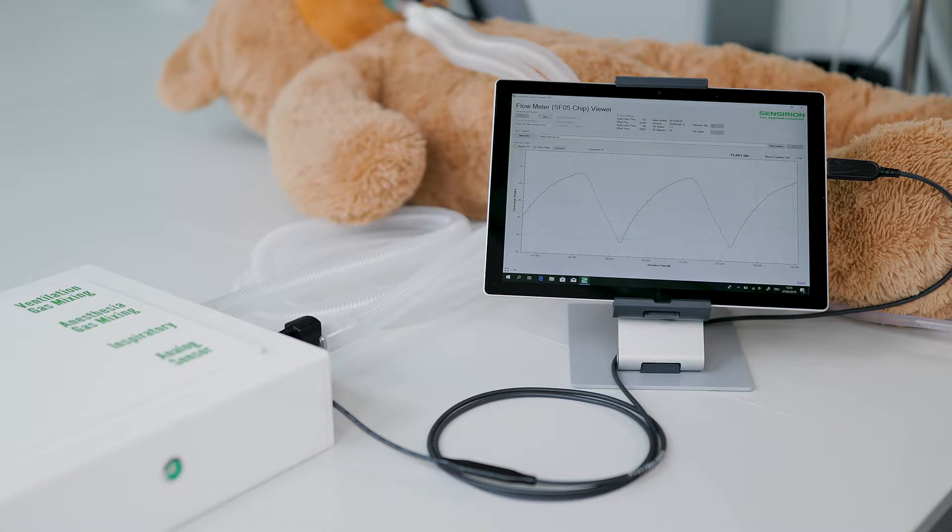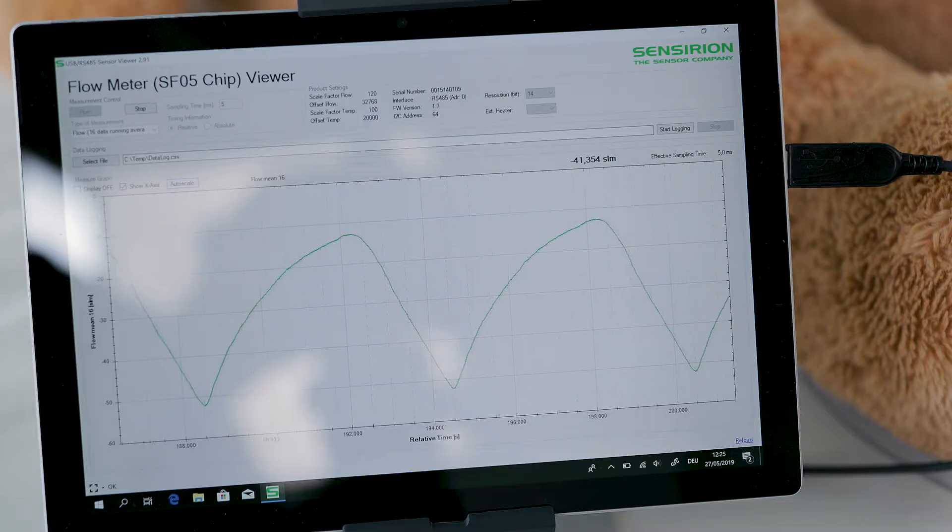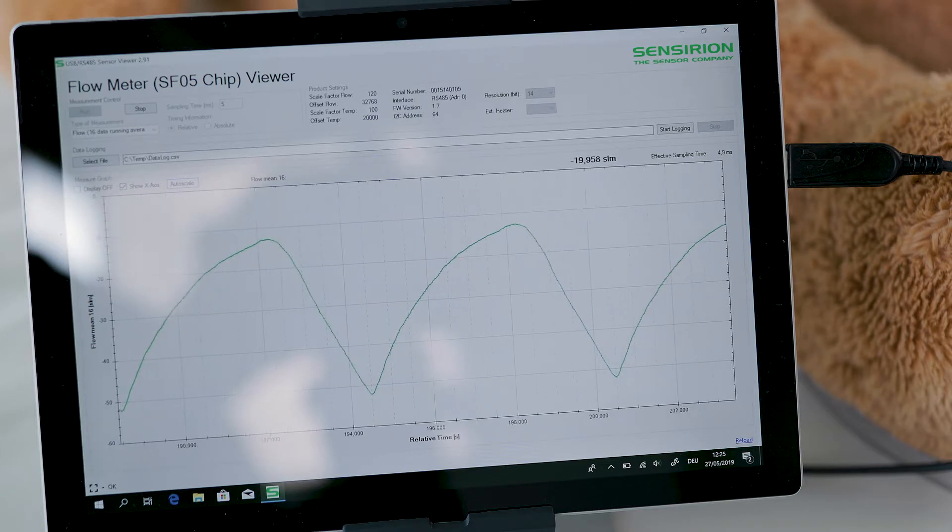In other words, we need a flow sensor that can take accurate readings even if the temperature and humidity varies and if the gas flow is low. And of course, we want to be able to clean it.